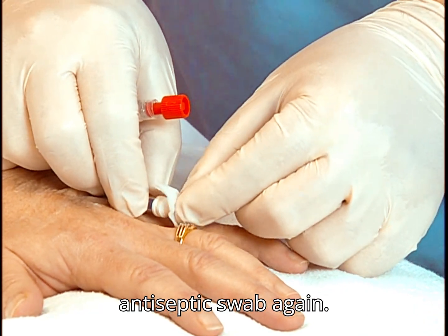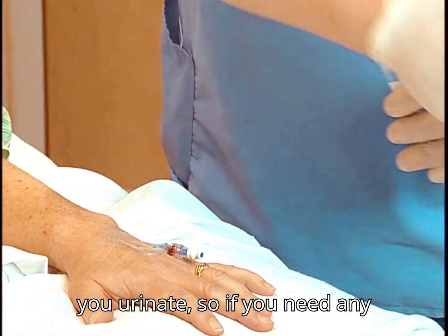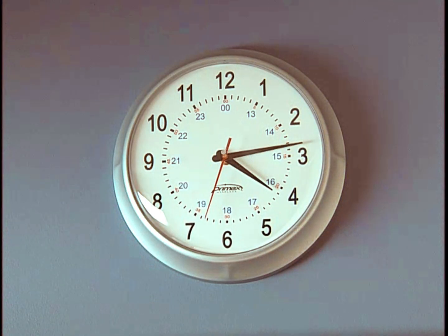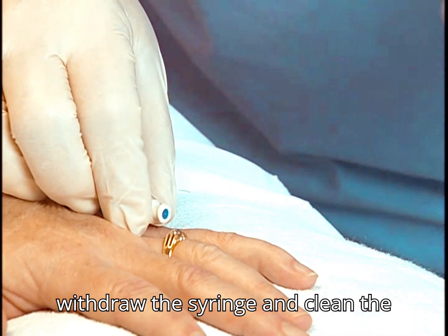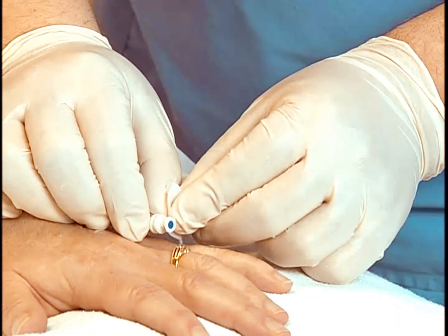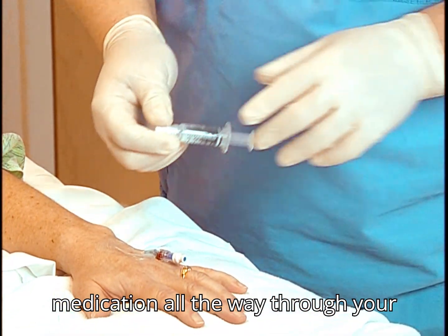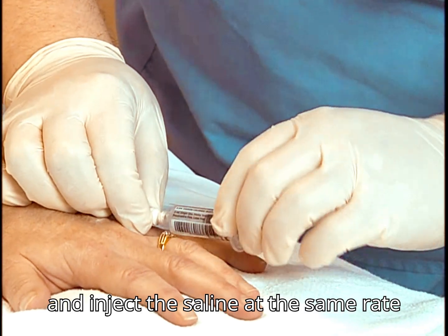Clean the lock's injection port with an antiseptic swab again. Now insert the medication syringe into the injection port and inject the medication within the recommended time. After administering the medication, withdraw the syringe and clean the injection port with an antiseptic swab again. Then insert the second saline syringe into the injection port and inject the saline at the same rate you used for the medication to flush the medication all the way through the saline lock.